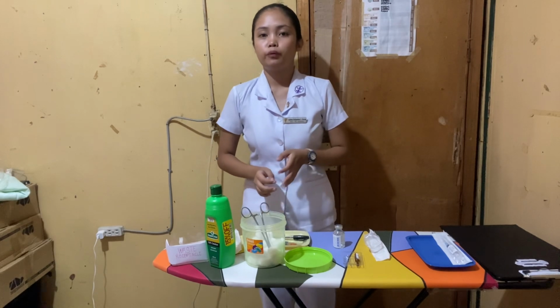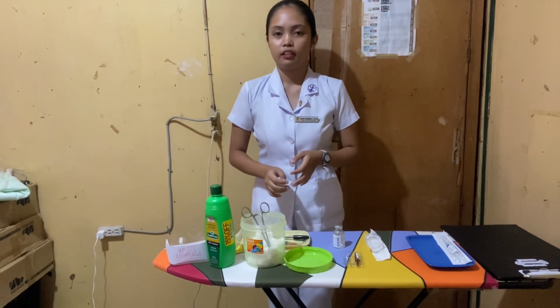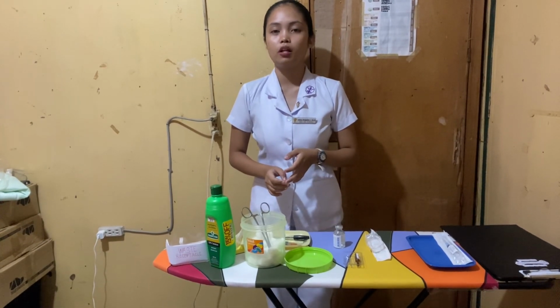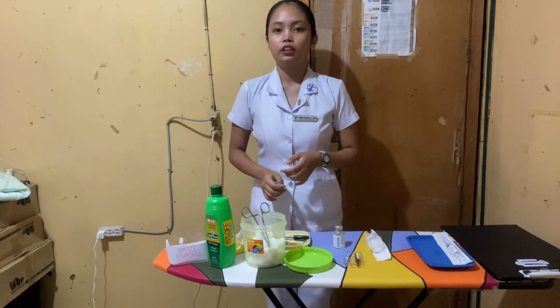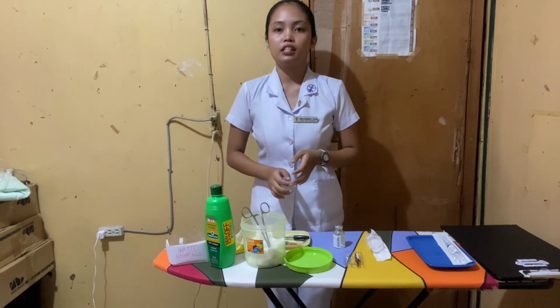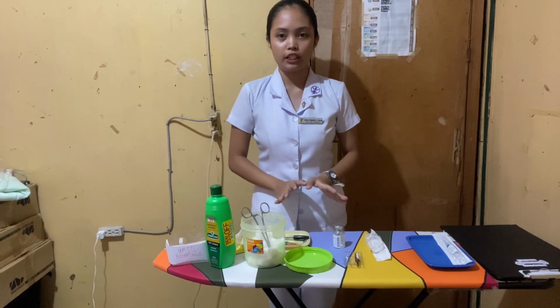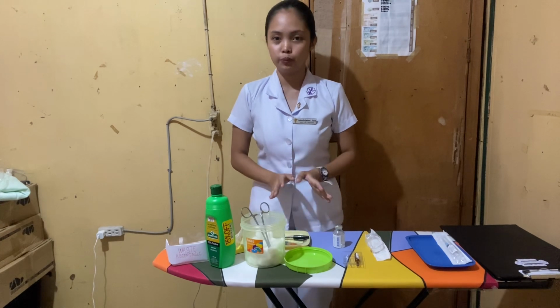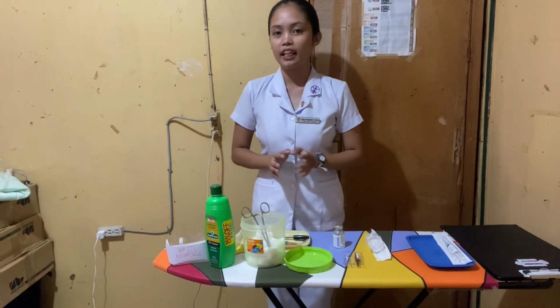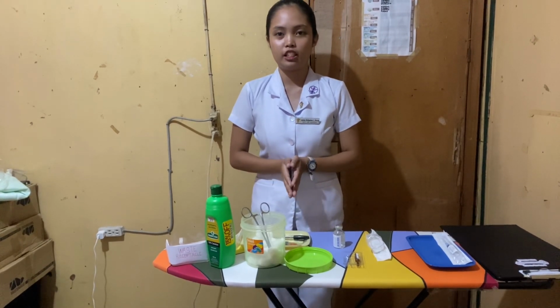Now I'm going to perform the subcutaneous medication administration. Subcutaneous administration is the introduction of a small amount of solution into the adipose tissue beneath the skin by means of syringe and needles. After preparing the medication, head over to the patient's room, introduce yourself to the patient, verify the patient's identity, and explain the procedure to the patient to ensure the patient's privacy.